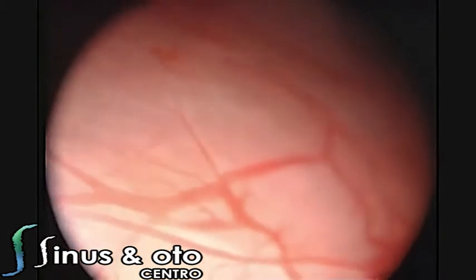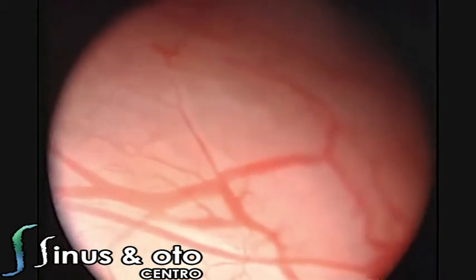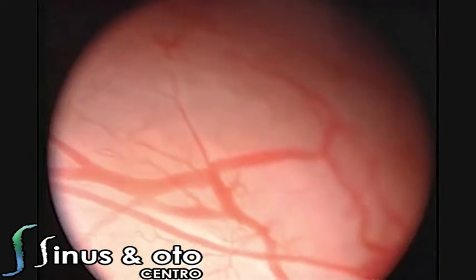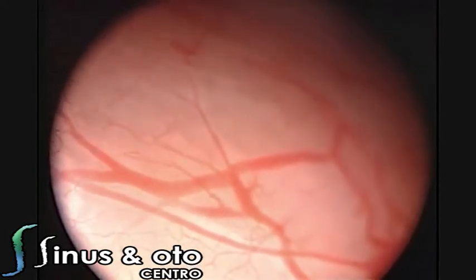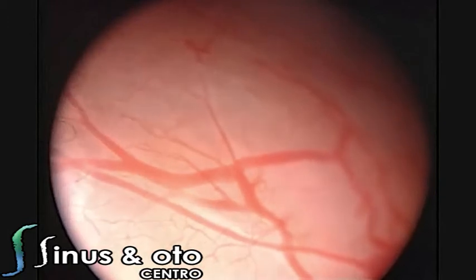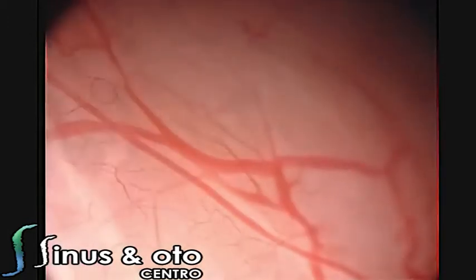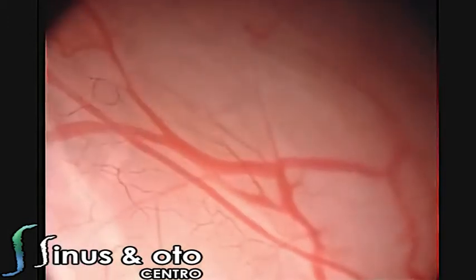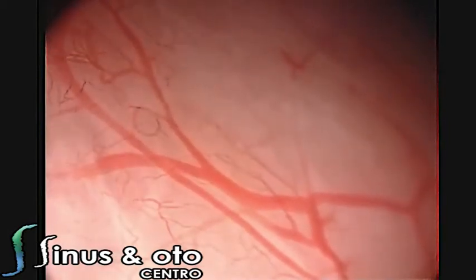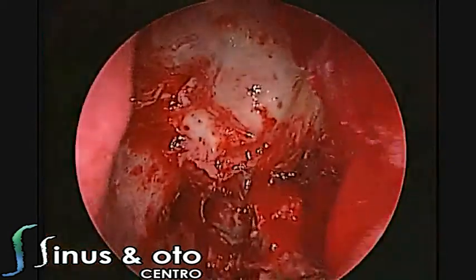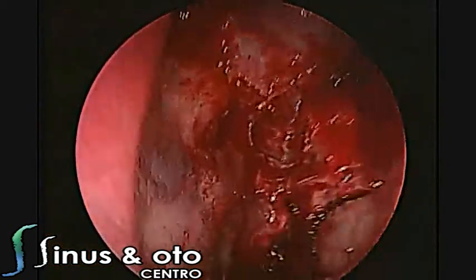Sometimes when you adjust the focus, you can see the red blood cells traveling inside the blood vessels — especially the smallest ones. You can see them in a very nice way; the bigger ones you can also see, but they appear in a much larger condition. You can observe the red blood cells traveling inside the blood vessels.